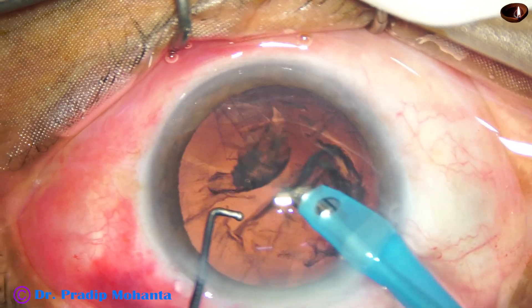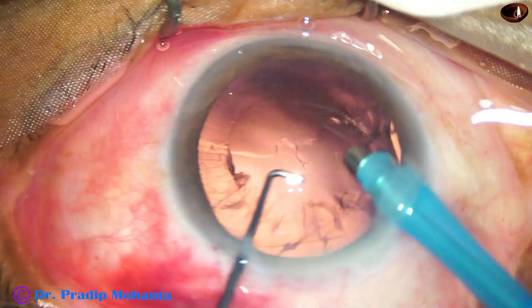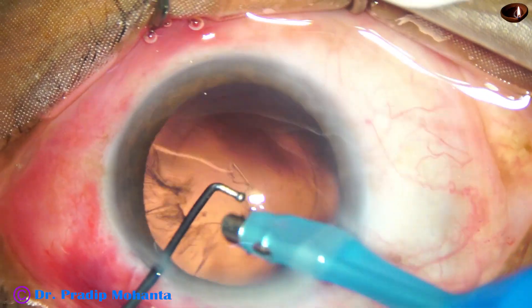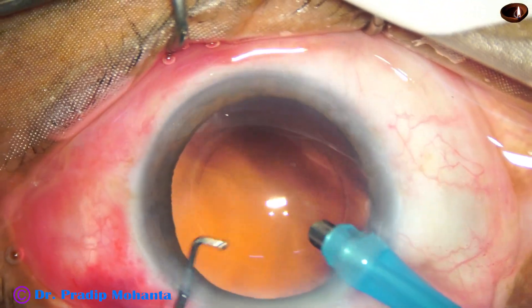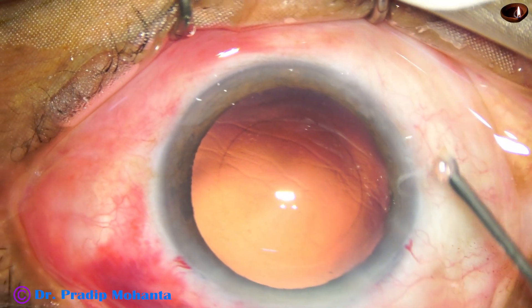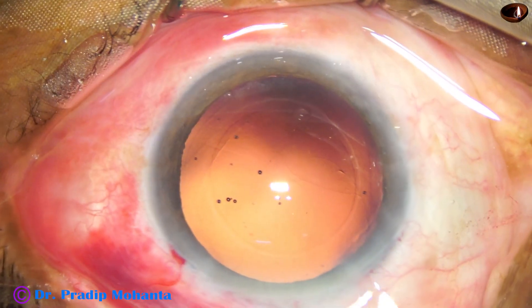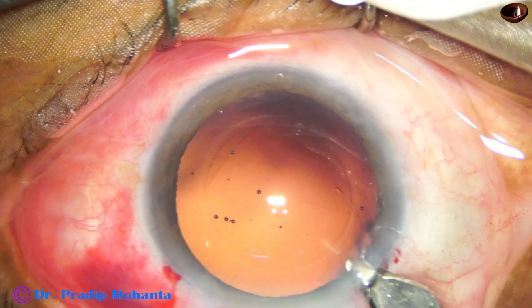Now see the epinucleus. The epinucleus is removed, and now I try to remove the cortex by the handpiece itself. Please don't try this. I have been practicing this for a very long time, maybe more than one year, and to do this you have a learning curve. You have safer options — you can use bimanual IA, coaxial IA, whatever. But don't try this with the handpiece.